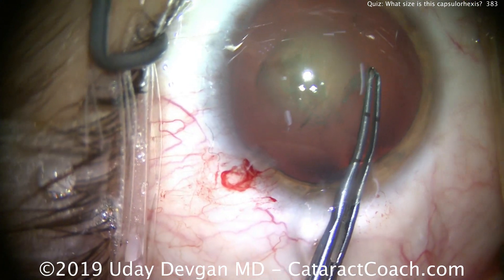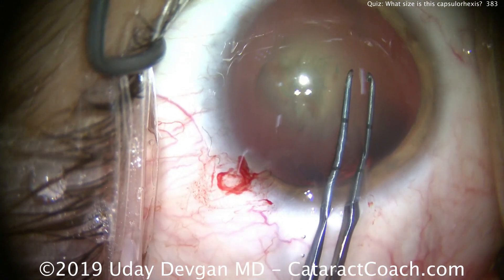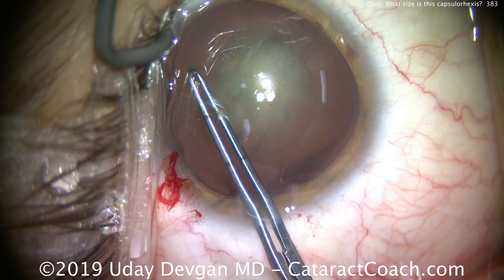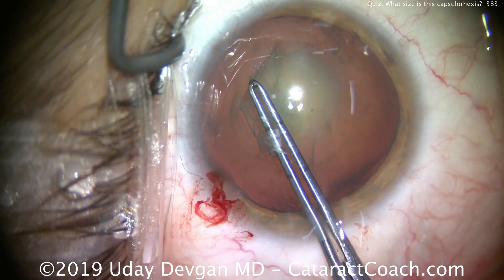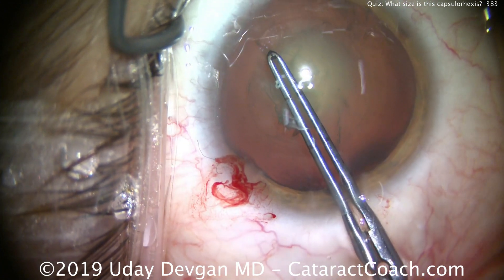The patient is paying better attention now, so we can take the chopper out of the paracentesis and continue our capsulorhexis just like that. The quiz question for this week: is this capsulorhexis too big, too little, or just about right?